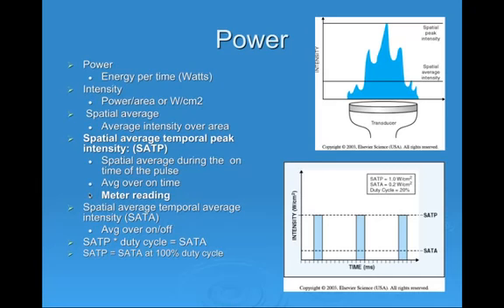All right, so just know that at 100% duty cycle the two are equal. All right, so one's just going to take into account the duty cycle, as it shows here in the little equation: SATP times the duty cycle is equal to the SATA intensity.